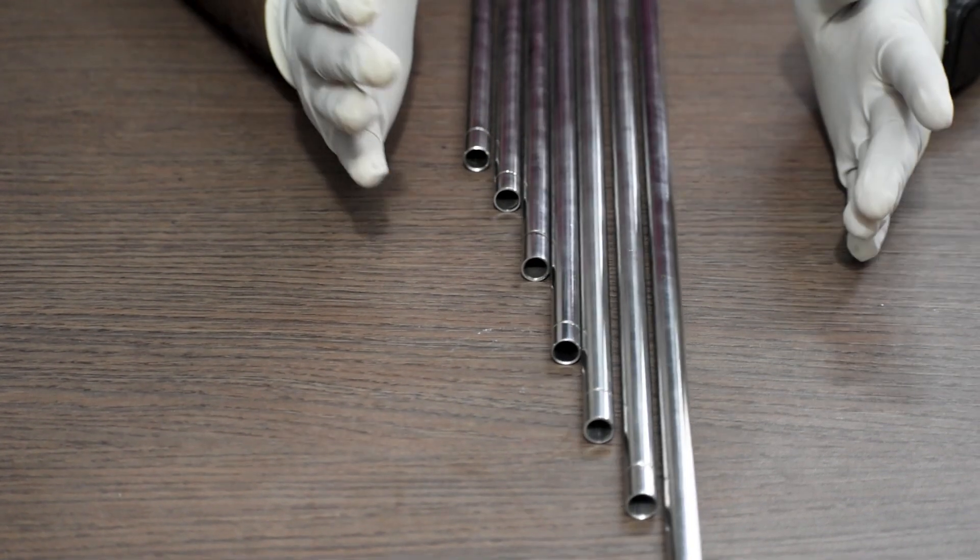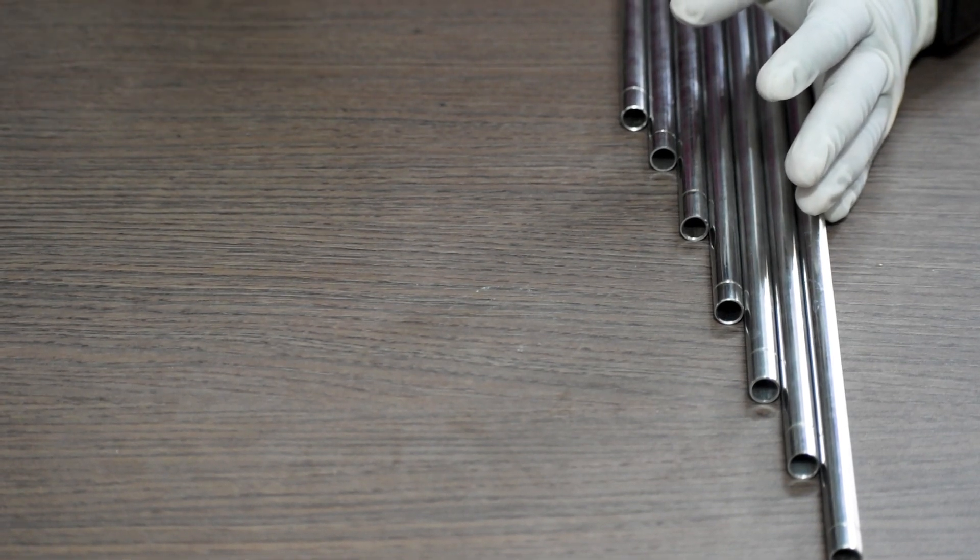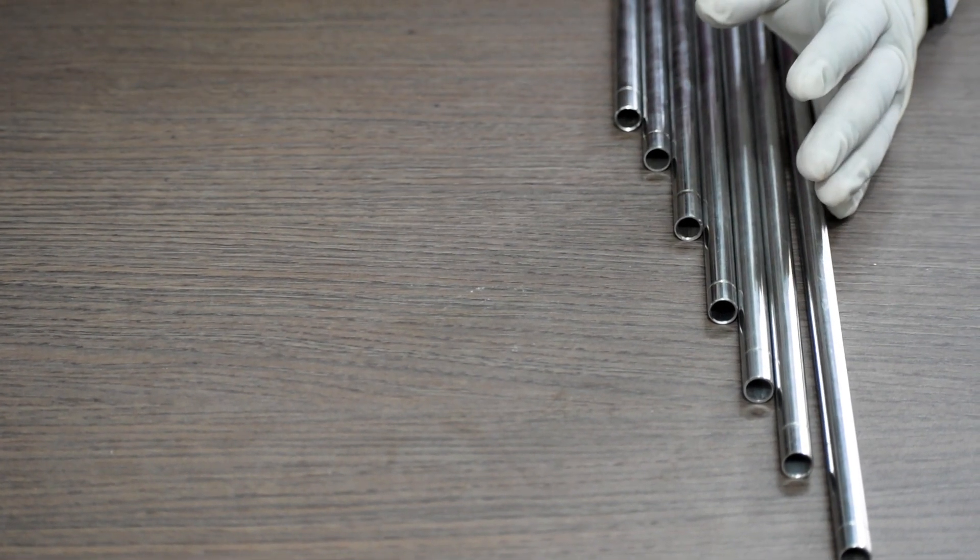Because femur is the longest bone in our body, up to 450mm size is used.